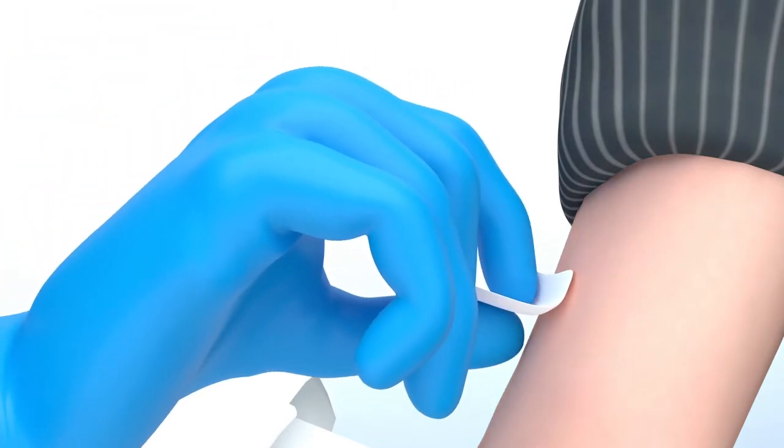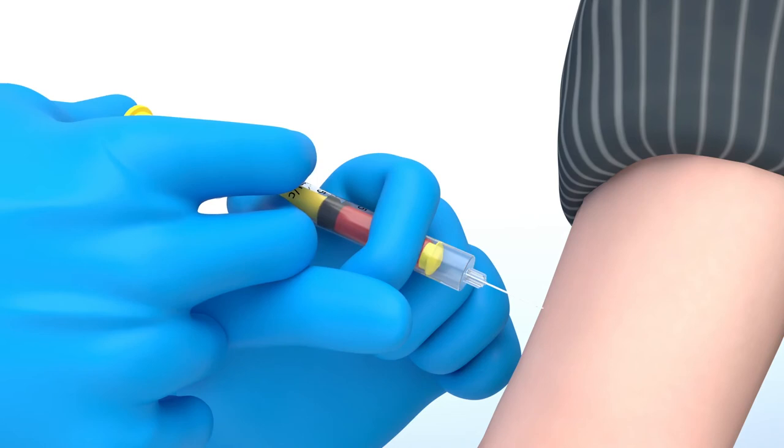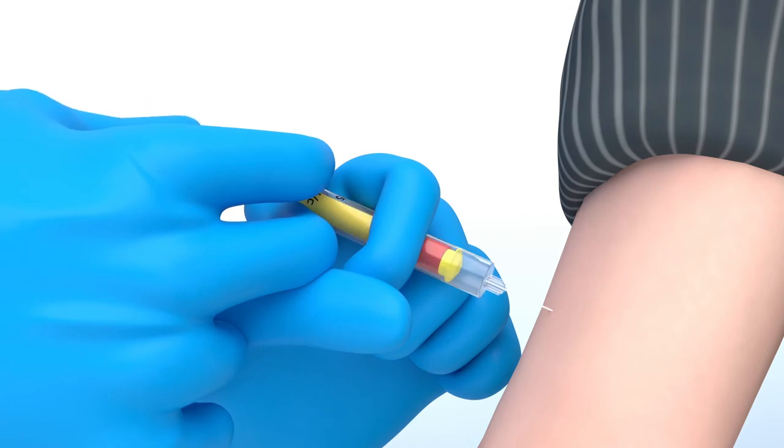Administer the injection, firmly pushing the plunger past zero to the top of the syringe. This action will automatically activate the retraction, drawing the needle safely into the syringe plunger.